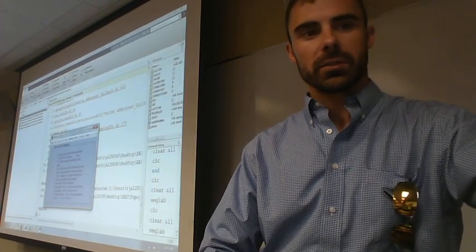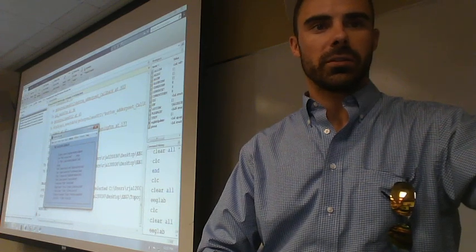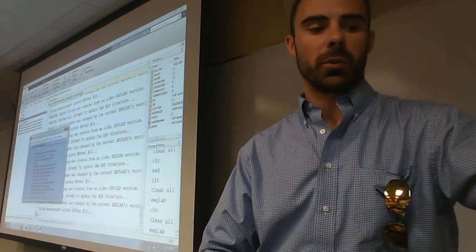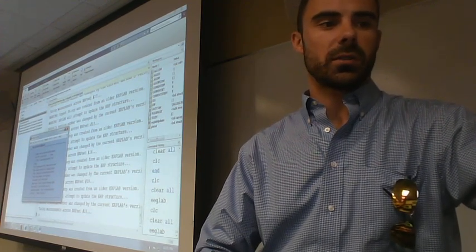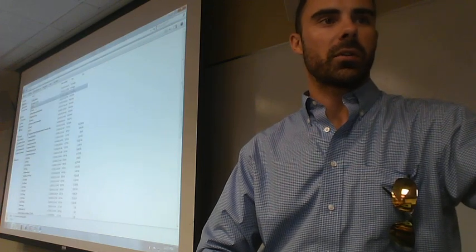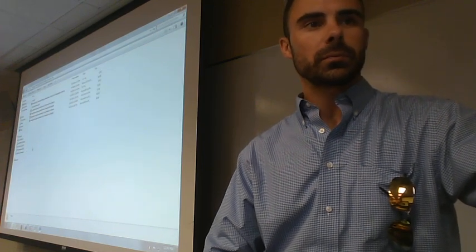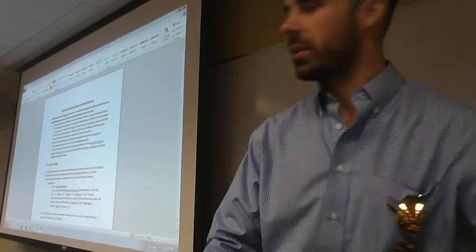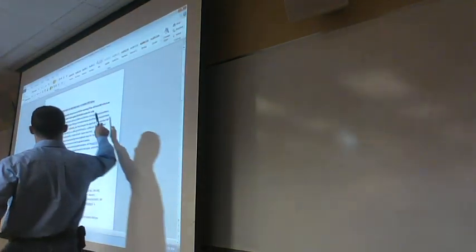Yes. So hopefully this ought to work, and it will calculate these statistical values. And then we're going to work with them. In particular, we'll open up some of our sheets and worksheets that were here in our topographic folder. So let's see here. In our instruction sheets, that's basically what we started off covering. While that's thinking, I'll walk through here. This is an introduction to the idea of understanding first the conceptual basis of what a topographic analysis is and what range normalization is. It refers you to the idea that it's addressing the spatial topography of an effect.